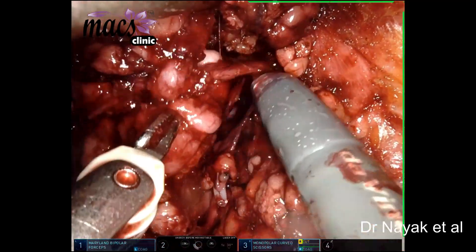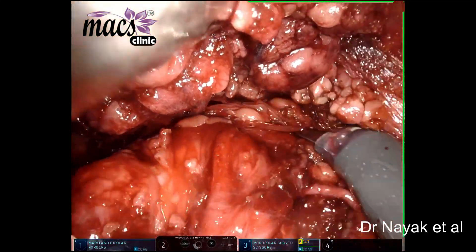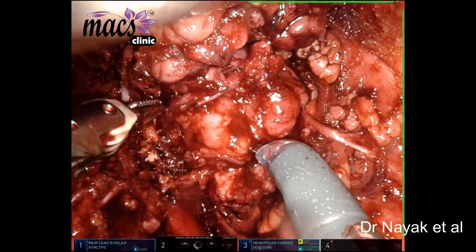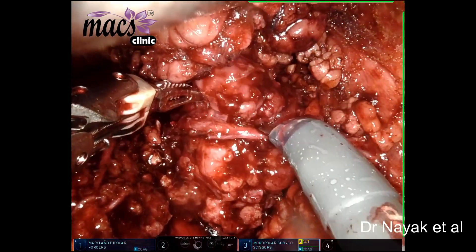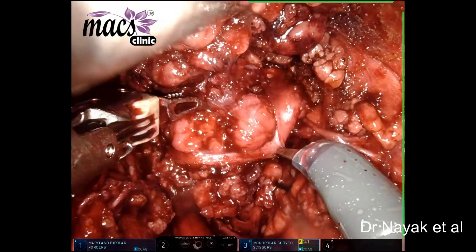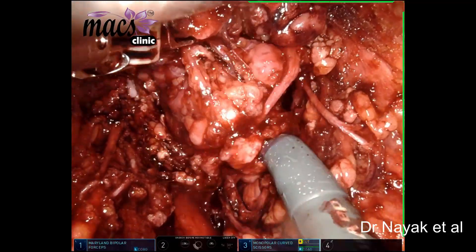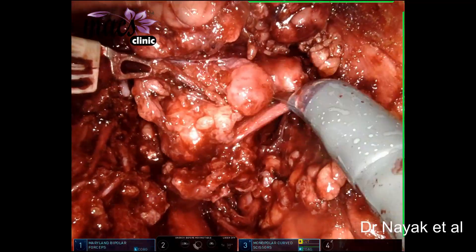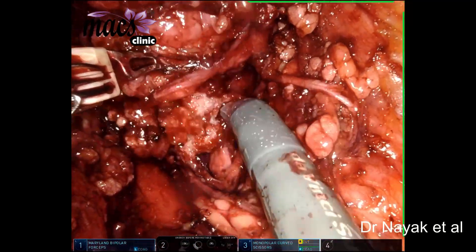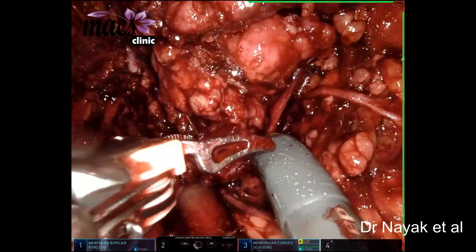As of today, the concept of parotidectomy is to perform adequate parotidectomy. It is not necessary to perform total or superficial parotidectomy — it is the adequacy of the margins and adequacy of the removal of tissue which is important. That is the nerve being gently pushed and the gland being removed.